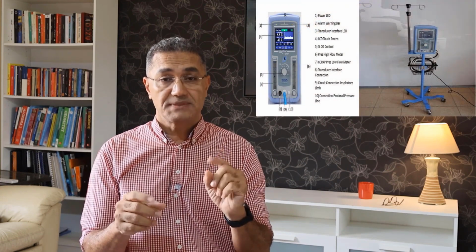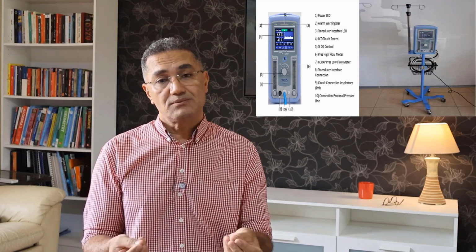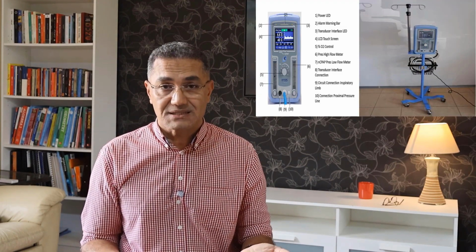There is something very important between the CPAP machine and the BiPAP machine. We said we have 3 very well-known devices: the CPAP, the BiPAP, and the ventilator. But the ventilator is used in a different way. A very important question will come up. Is there a difference between the CPAP machine and the BiPAP machine?